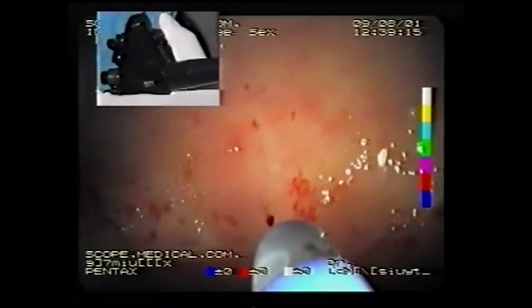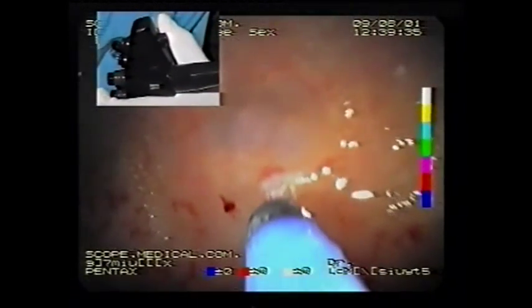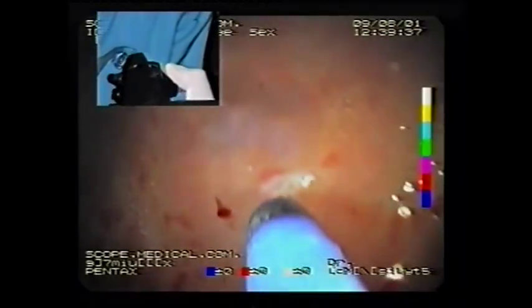So now we have 60 watts, and we will activate now. I have to come a little bit closer. No, it doesn't work. Maybe the neutral electrode, is it really? Okay, now it works.